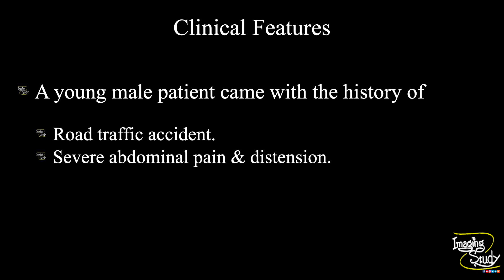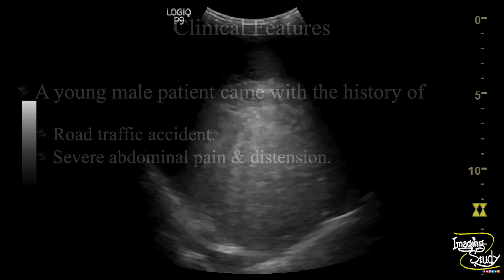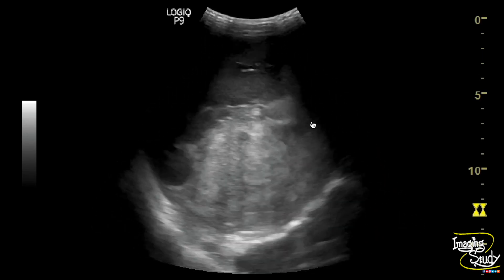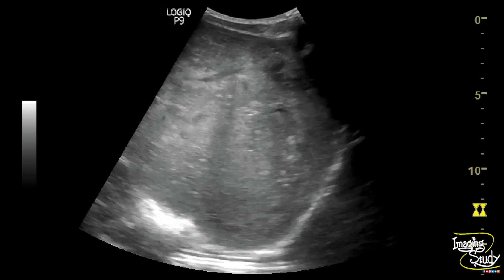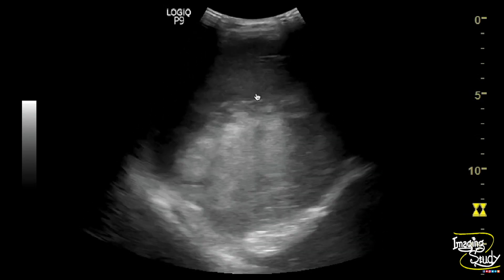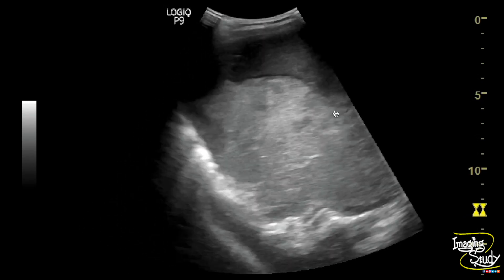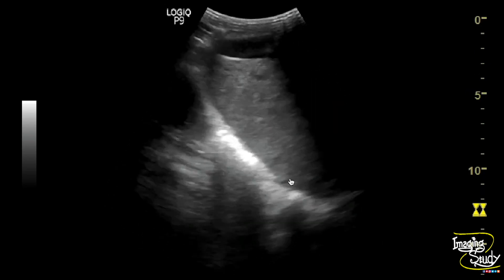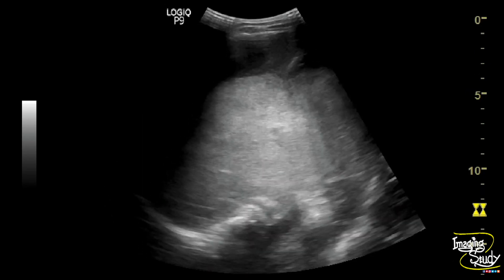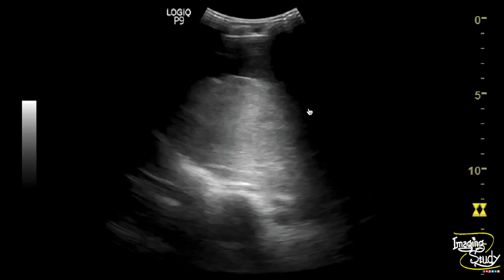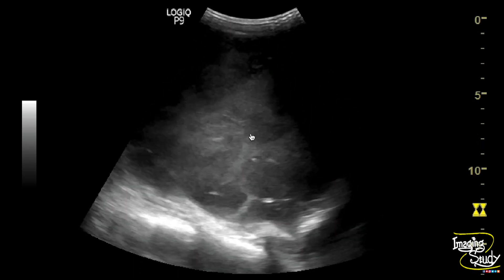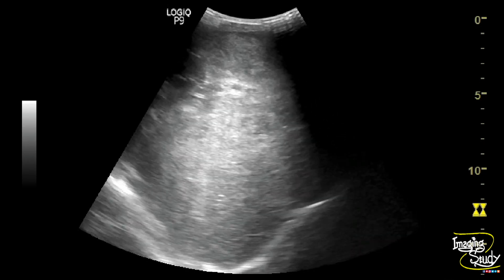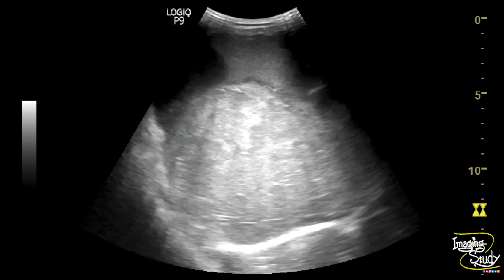Let's see what we have got on ultrasound. Here you can see the right hypochondriac region shows a sub-diaphragmatic heterogeneous irregular echogenic collection. The adjacent hepatic parenchymal distortion is seen. The capsule is not intact. You can see the right kidney is displaced posteriorly and surrounding bowel loops are displaced also. This hyperechogenic mass-like area is the hematoma. The overall hepatic parenchymal echotexture is heterogeneous due to trauma.